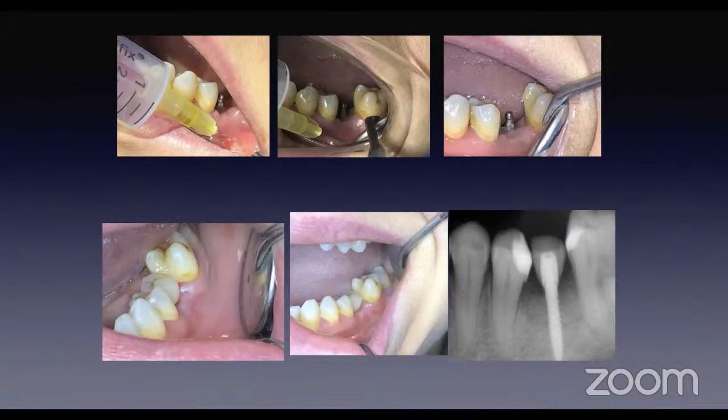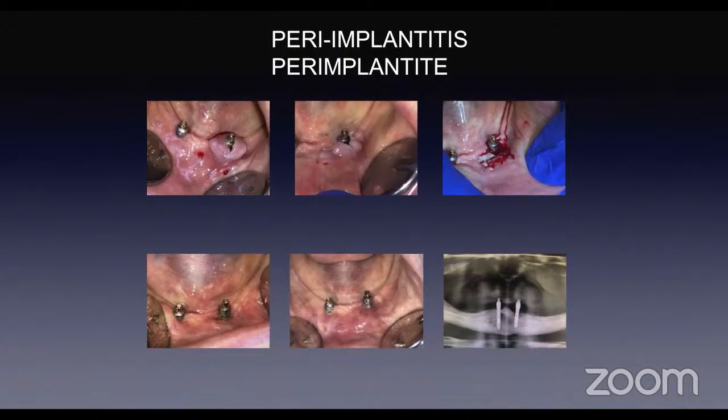So let's start talking about it before. This is a bone regeneration and a mini implant that had lost 5 millimeters of bone. So we decontaminate the area with ozone before surgically entering, and then we remove all the granulation tissue. So we clean all the area again. So we apply ozone oxygen, both on the screw and on the operating site. We consider the different phases, different moments of healing, and we replace the crown on top of this implant. And bottom right, we see bone regeneration obtained with a very simple intervention. We just have to decontaminate with effective means our titanium element that we should decontaminate.